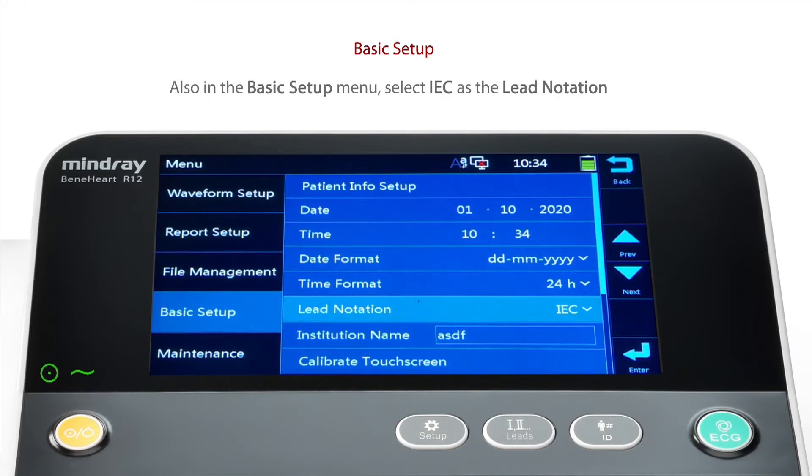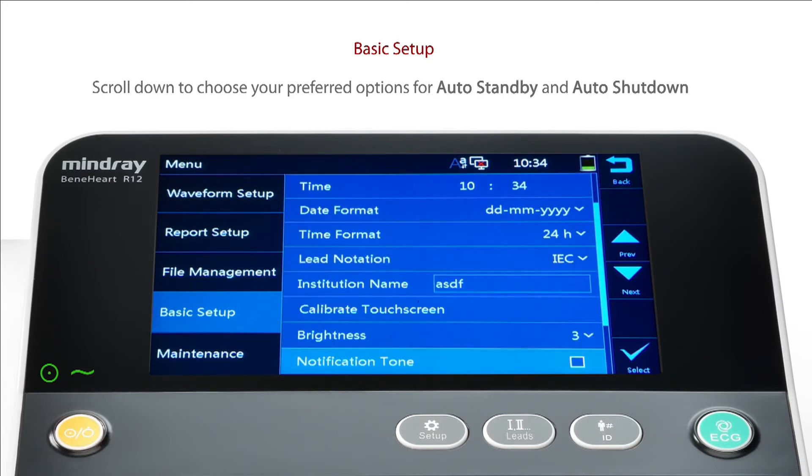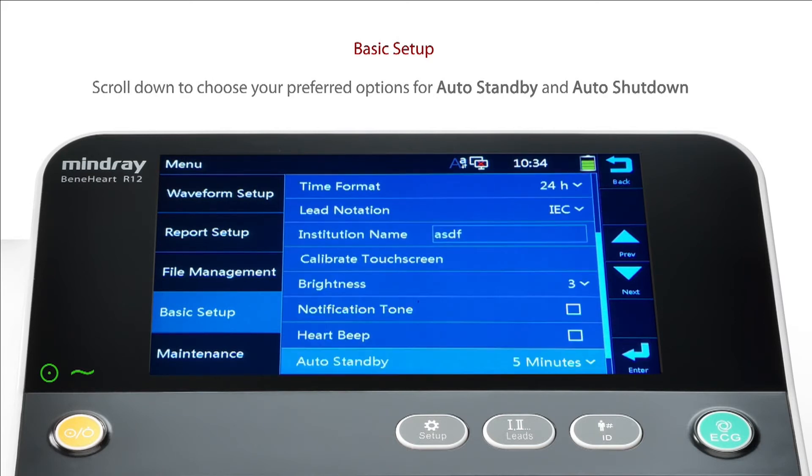Also within the Basic Setup menu, select IEC as the lead notation. Scroll down to choose your preferred options for Auto Standby and Auto Shutdown.